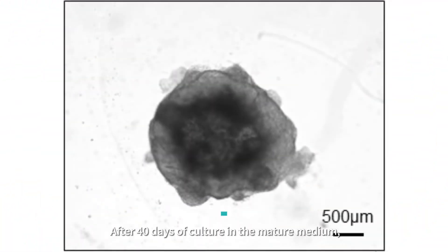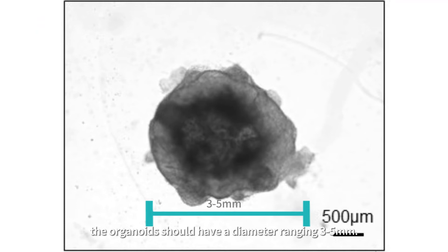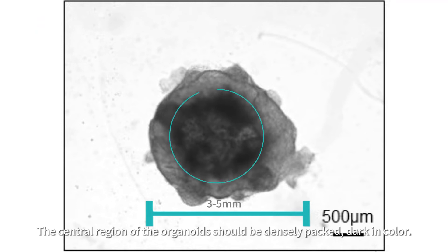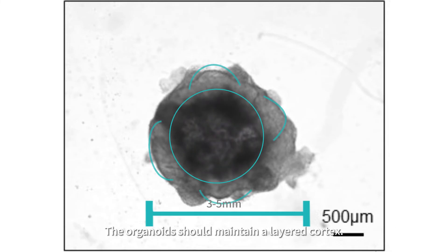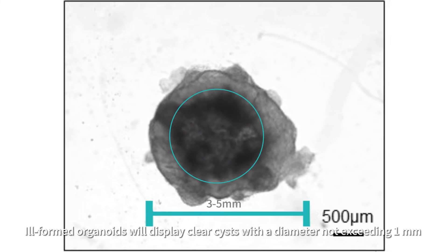After 40 days of culture in the maturation medium, the organoids should have a diameter ranging 3 to 5 millimeters. The central region of the organoids should be densely packed and dark in color. The organoids should maintain a layered cortex. Ill-formed organoids will display clear cysts with a diameter not exceeding 1 millimeter.